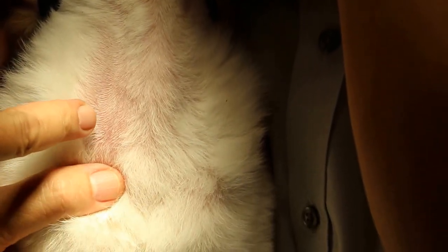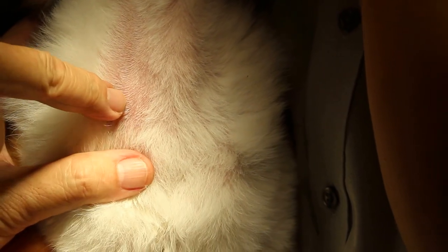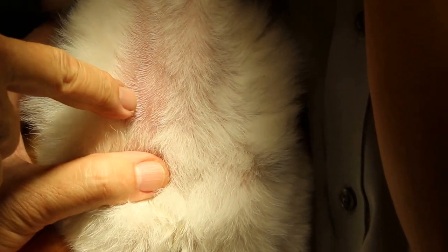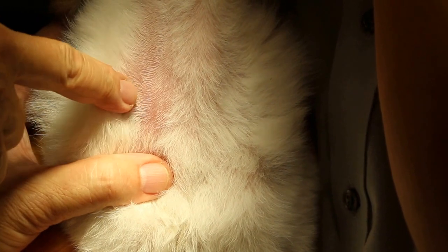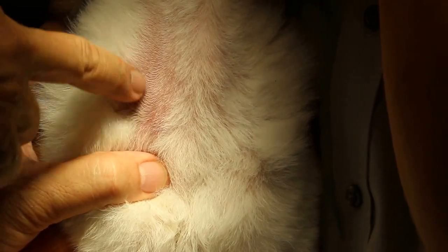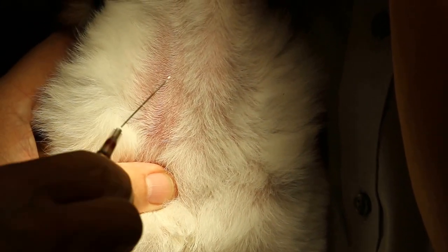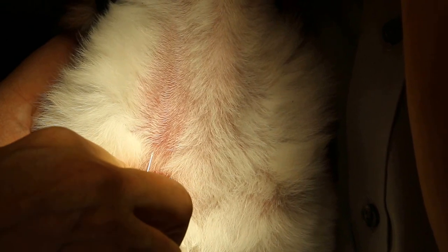So bend the needle a bit. If you can see — it's good — you can actually see there's a swelling. Do you see the swelling? There's a bit of swelling here, so there's the jugular vein. And this is the same thing for the cat also. So for the cat too, this will be the jugular vein.